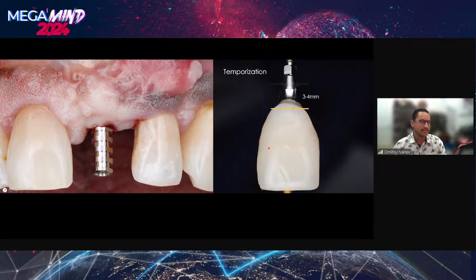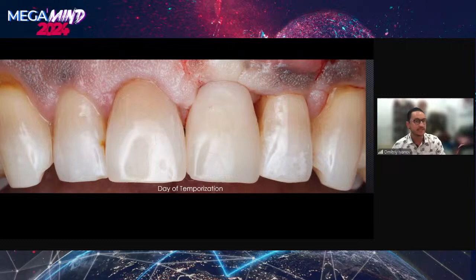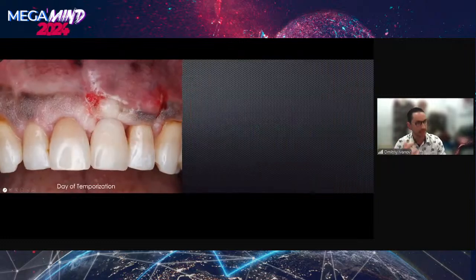Subgingival contour has to be extremely narrow, not to put too much pressure laterally. We're only putting pressure in this critical zone to create adequate zenith position for the future restoration. But proximally, we want to leave as much space as possible, always leaving a lot of space. It appears that there's some push of the papilla apically. Not to worry, everything is very concave inside, so we should be able to recover that papilla. It's going to start growing.